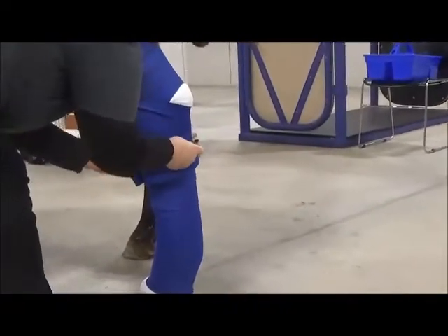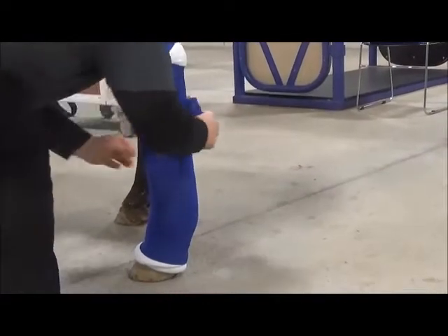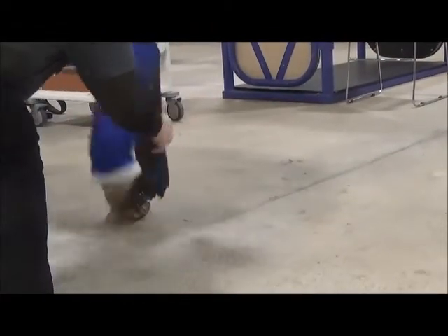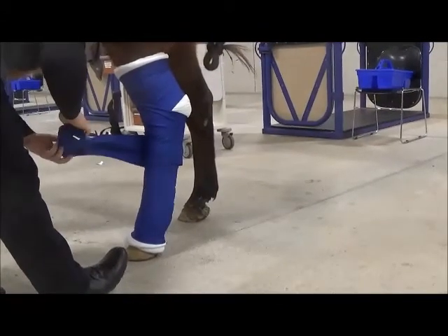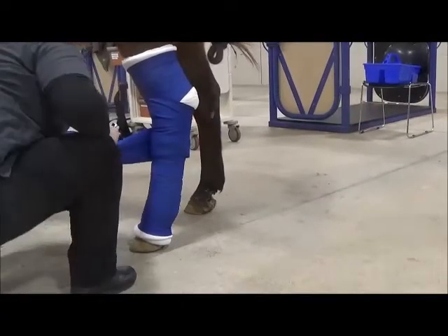So I'm going to come back down to the lower part to finish my bandage below the hock. So if that happens, just re-roll your bandage back up.